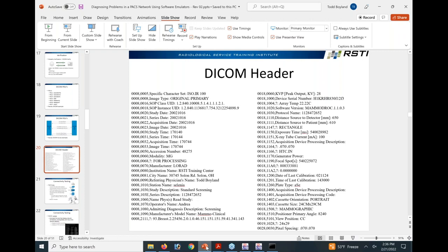Was this successful? Yep. Look carefully. B000. Oh, on the other side. It looks like a 0. It's actually a Bravo. Bravo 000. Do I see that in the status field? Right below there, the next tag, it says set instance number to 0. So this failed because the instance number was missing.